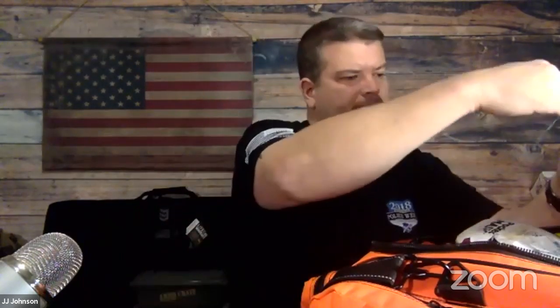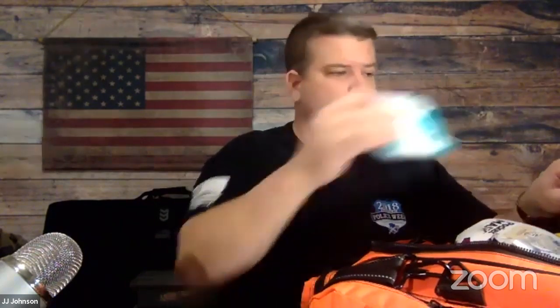And then we've also got some Dentek Temparin Max, and basically that's like you chip a tooth or something, you can put some of this stuff on there. Kind of keep the ends from being exposed as much and all that. At least that's my understanding. I'm not a medic. When I was a SAR instructor, I was trained to about a wilderness first responder level, and that and some other basic trauma type stuff are about the extent of my medical training.